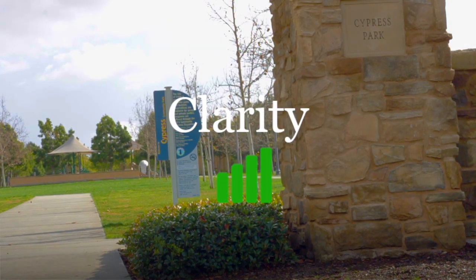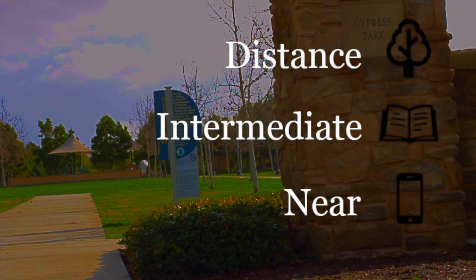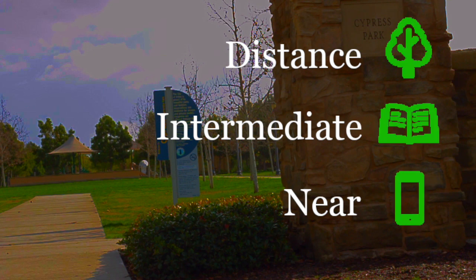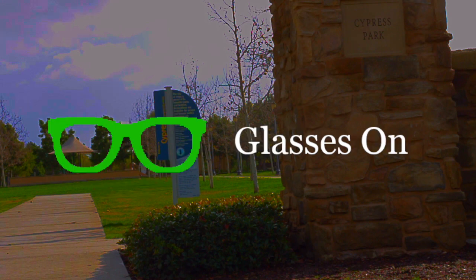Next is clarity, which is how sharp the image is. Here, the image is very sharp, and we're able to easily read the word Cypress Park in the top right corner in the distance. These icons to the right will indicate the distance that we're looking at, and will turn green to show how far we're looking. The tree indicates far in the distance. The book indicates an intermediate distance, about an extended arm's reach. And the phone indicates near vision, holding something near your face. Lastly, this icon will appear if the vision is with no glasses being worn, and this icon will appear when this is the vision with glasses on.